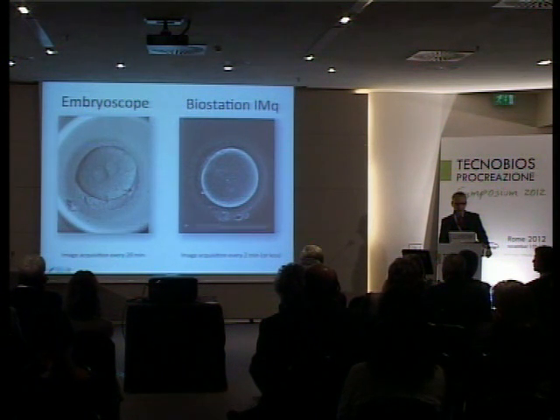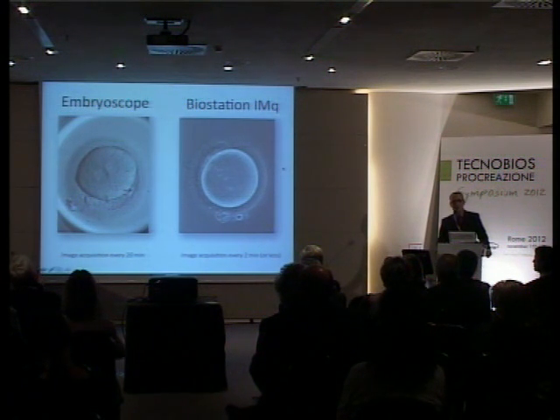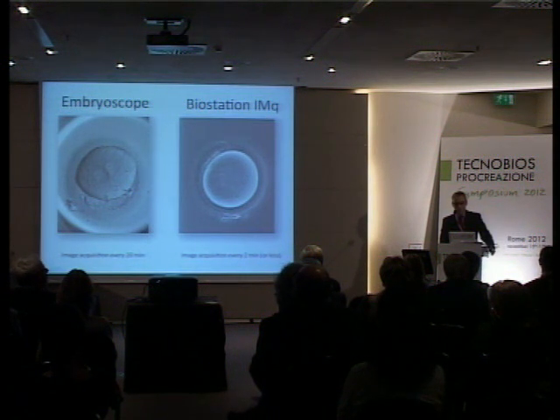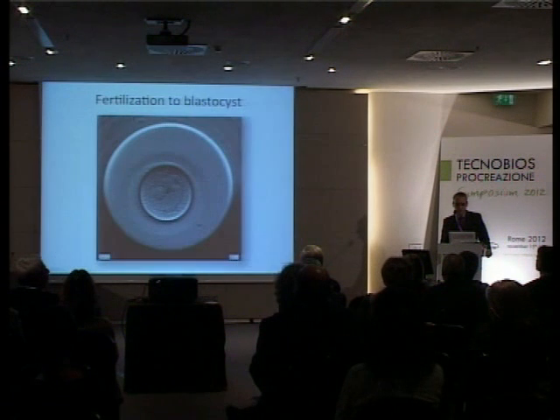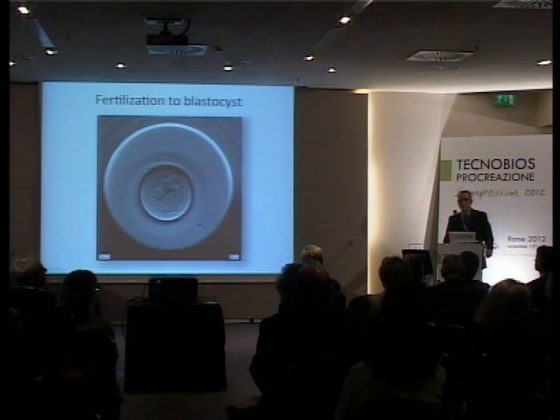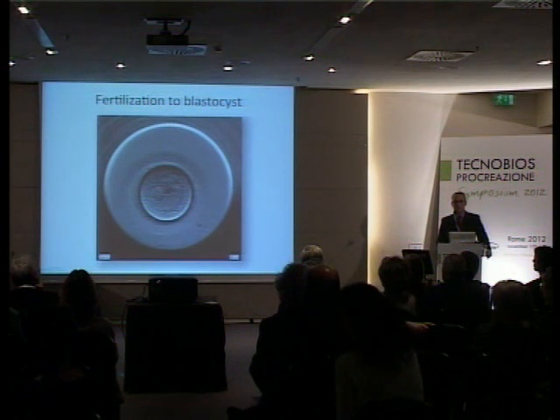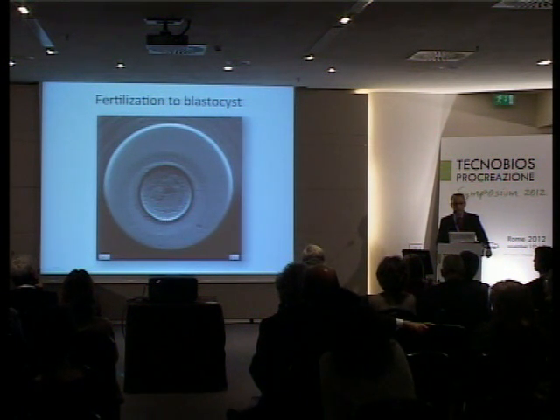But if we look at the same process with another device, which is in fact developed for basic research, we can see a number of fluctuations, oscillations, and waves of the cytoplasm which are missed in the other kind of observation with the EmbryoScope. So the EmbryoScope is a suitable, very powerful tool, but it has limitations, and we have to acknowledge that.